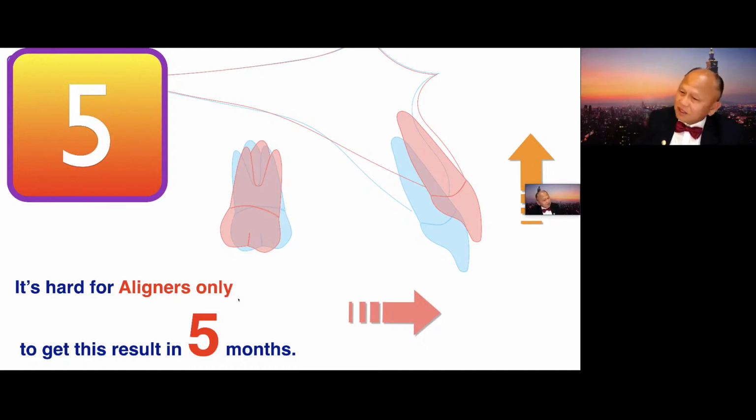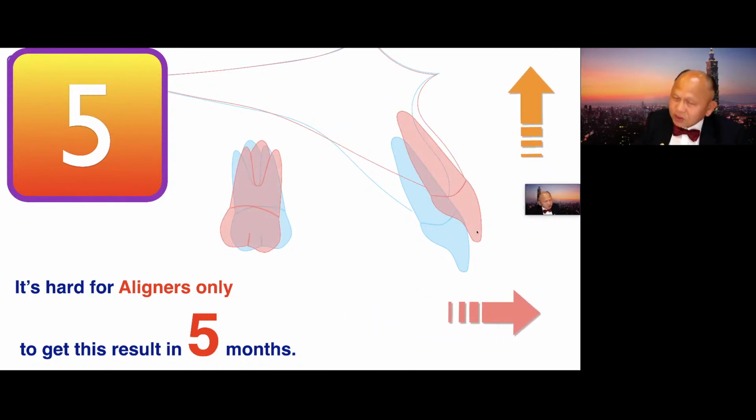I bet it will be very, very difficult to intrude the incisor and flare the incisor. Remember, the weak point from those studies, they talk about how it is very difficult to intrude the upper incisor. But with bite turbo and class 3 elastic open coil spring, it becomes a piece of cake. Easy. So if it's powerful, why not do it?